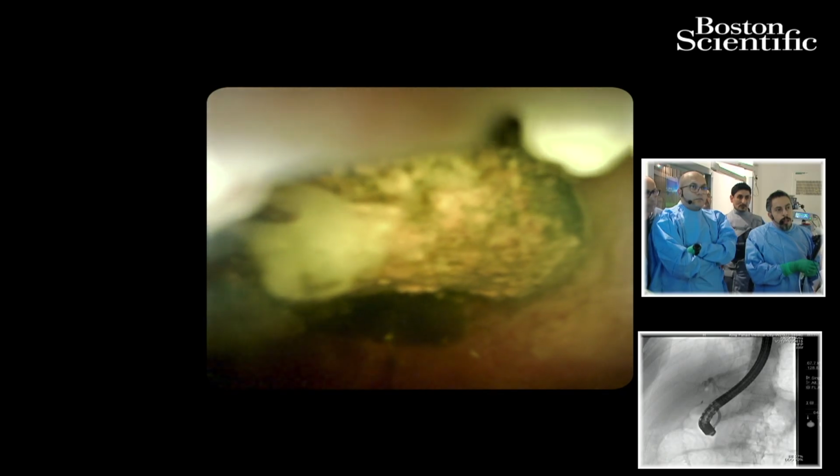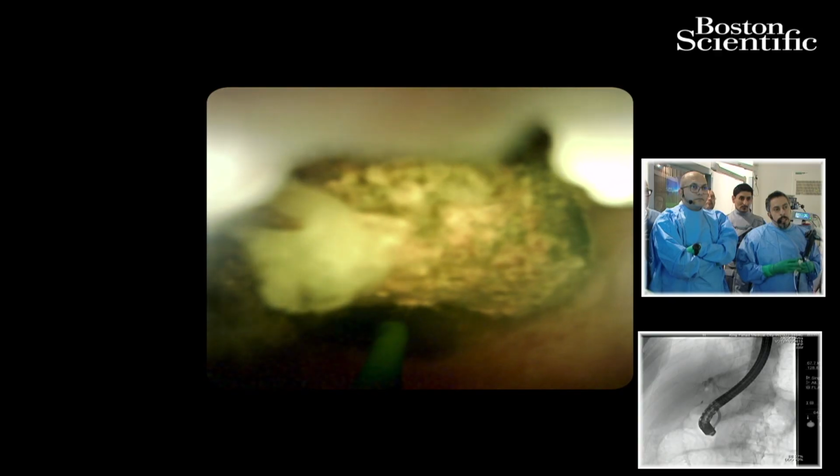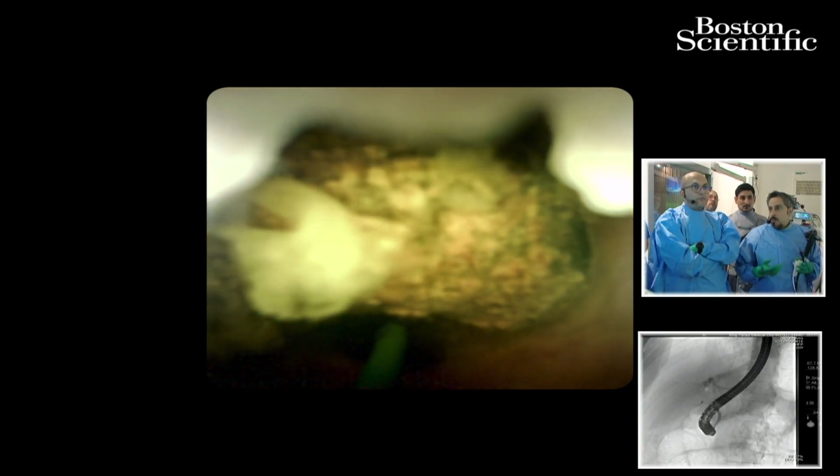So as you can see here, with the probe we try to be around 1 or 2 millimeters away from the stone. We try to crush from the middle, and then we go in a circumferential fashion.